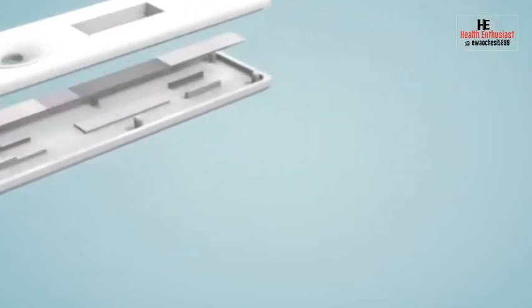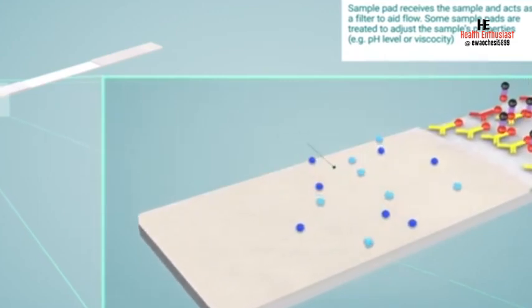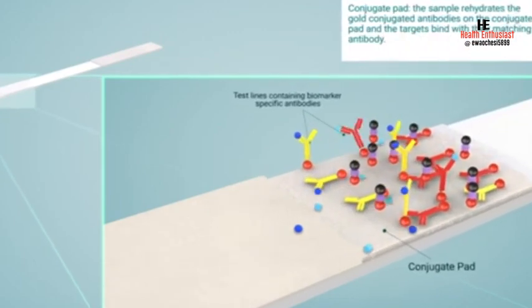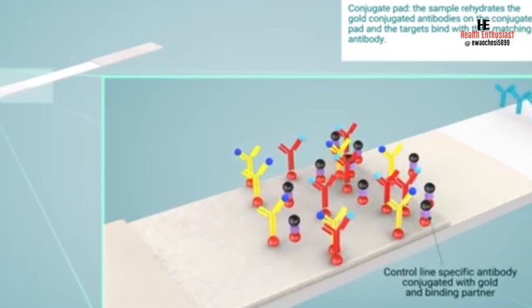So what really is an analyte? The analyte is just the substance of interest we are testing for. For example, hepatitis B surface antigen in blood is an analyte, HCG in urine for pregnancy is an analyte, or amphetamine or morphine or THC in urine is an analyte, right?